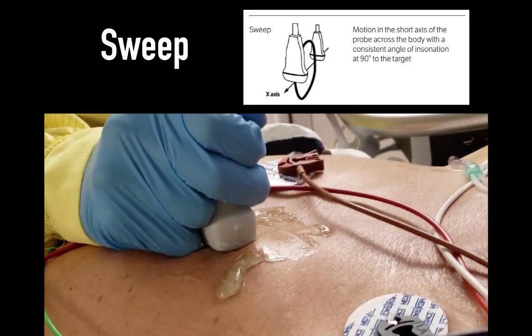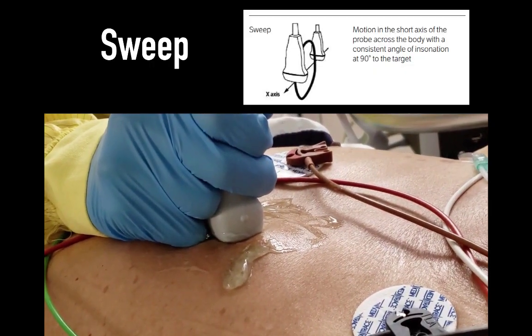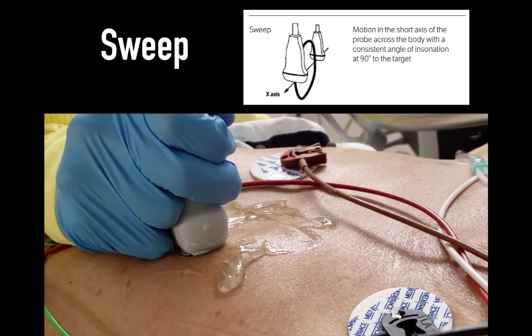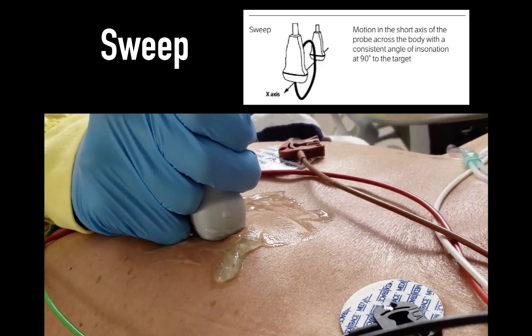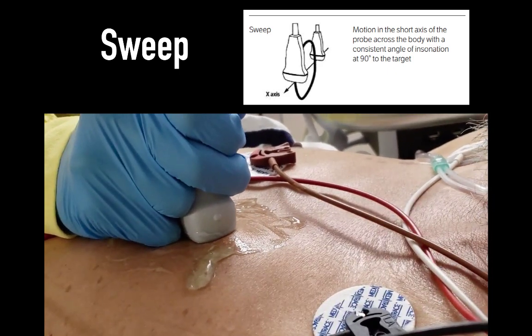Sweeping is motion in the short axis of the probe. With a consistent angle of inclination at 90 degrees to the target, in this case, the head of the probe actually moves on the body, but moves perpendicular to the long axis of the probe, or perpendicular to the probe marker.